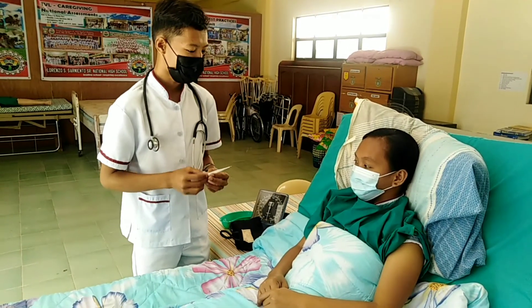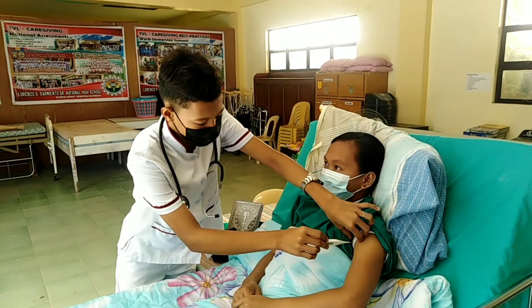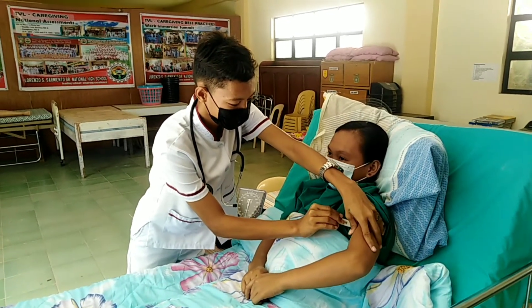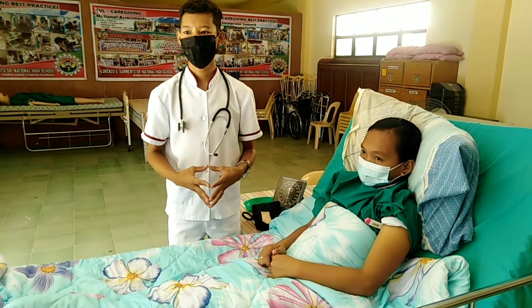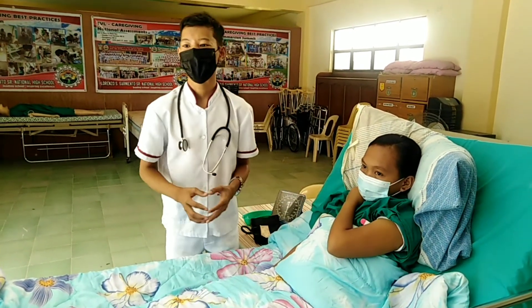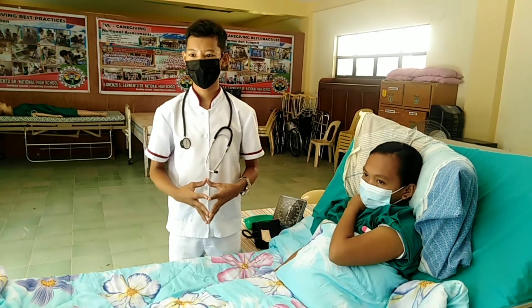Ma'am, I will put the thermometer in your axilla. Keep the arm flexed across the chest, close to the side of the body. Hold the thermometer in place and wait until it beeps and indicates that it is done reading.